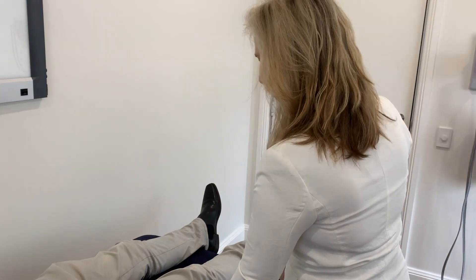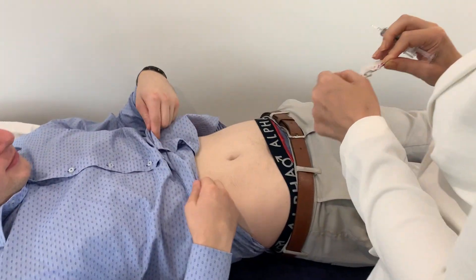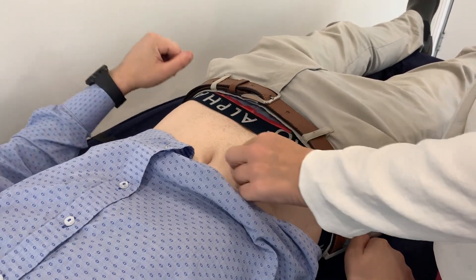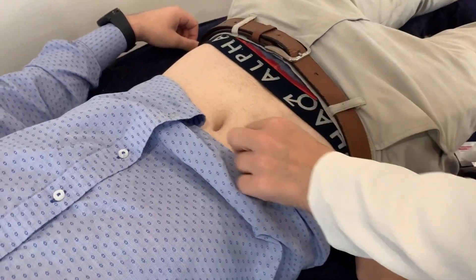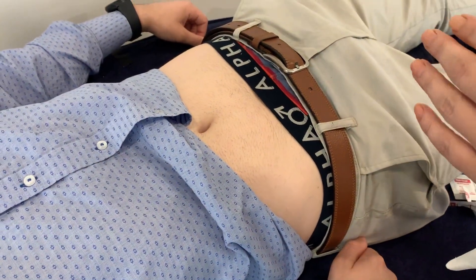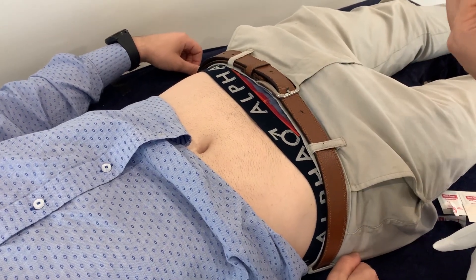Next, you find the spot where you're going to do the injection and you make sure you really clean the area with an alcohol swab — be very, very firm with that. Now you rotate each side its turn, so one time you do it on the right, the other time on the left. Give it a little bit of time to dry.